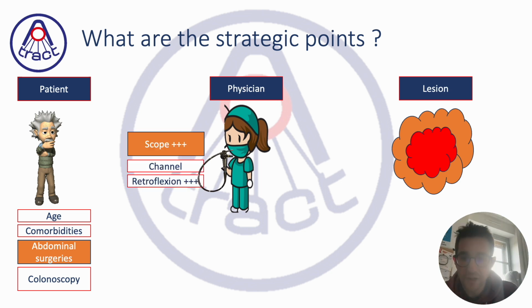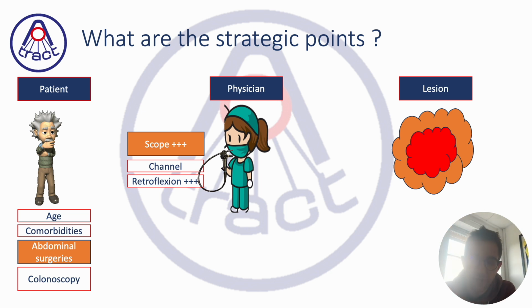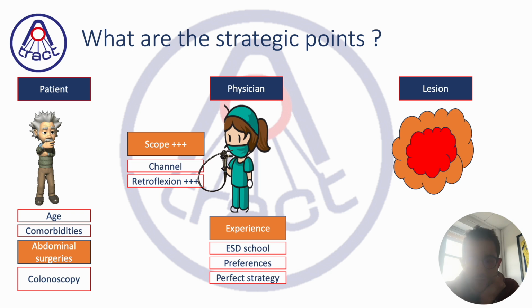Or is it quite easy? About the physician now. Which scope do you have? Which channel? Which retroflexion power is available? What is your experience? Which part of ESD school are you working on now? I mean, is it for you a high experience of colonic ESD, or is it one of the first cases in the colon?